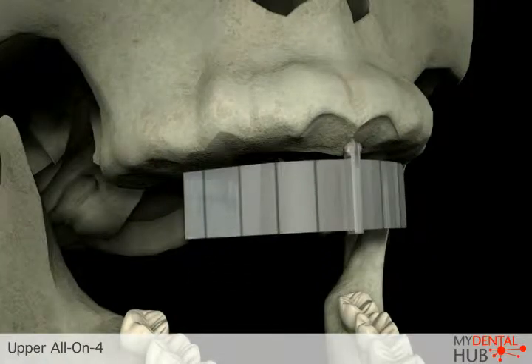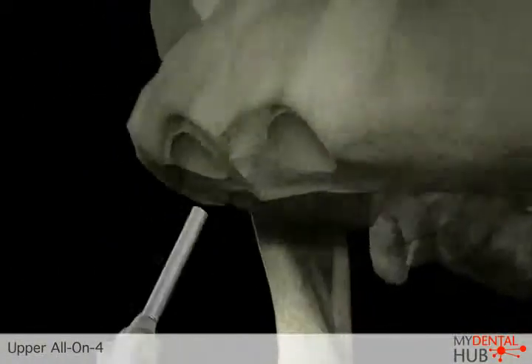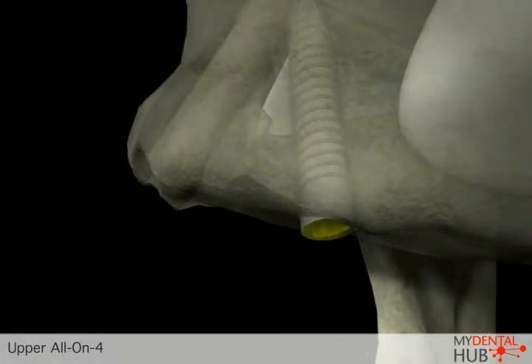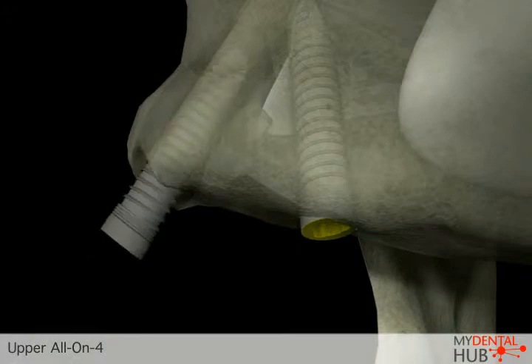A surgical template is used to assist in the placement of implants at specific sites and specific angles to support the final restoration. Typically, four implants are placed in the jawbone.